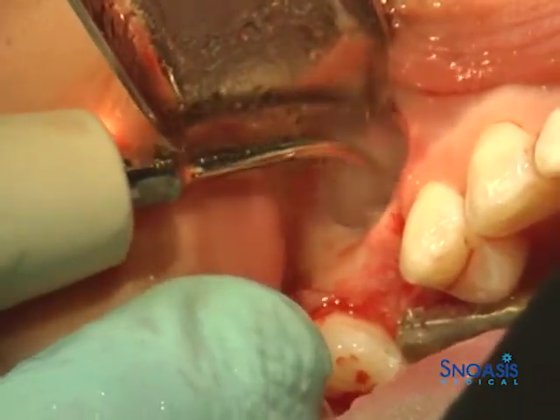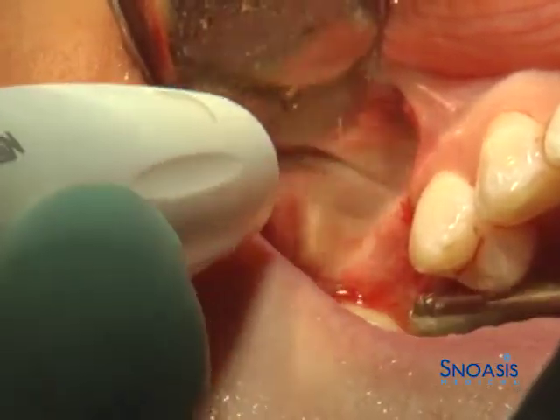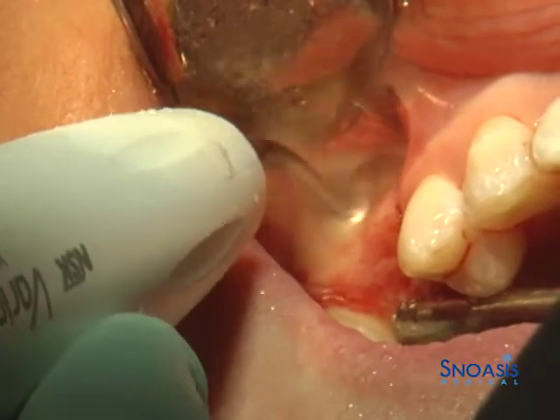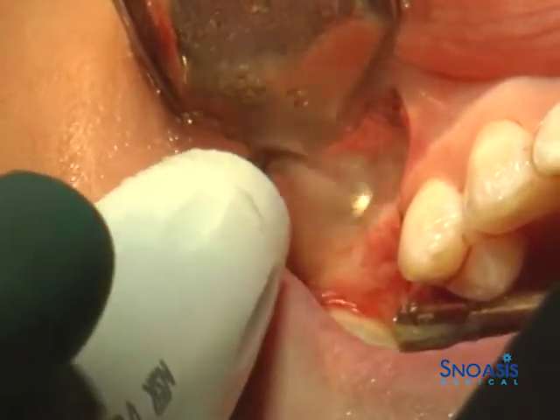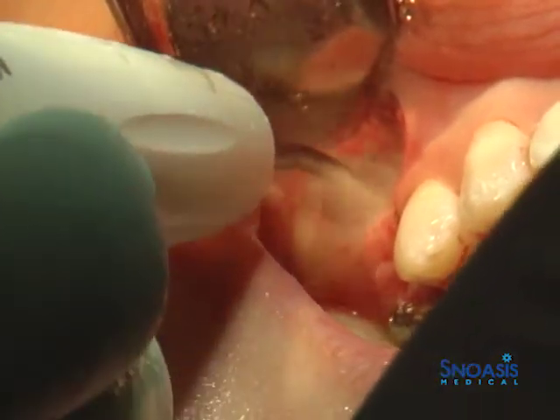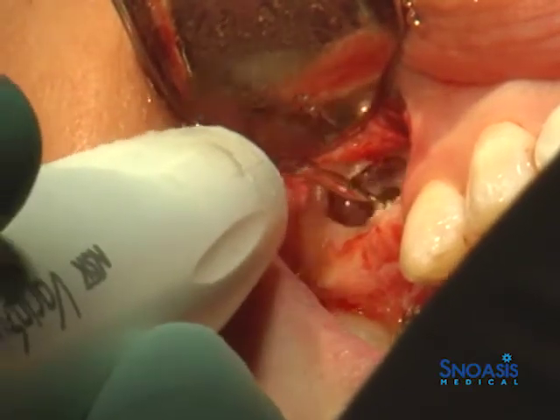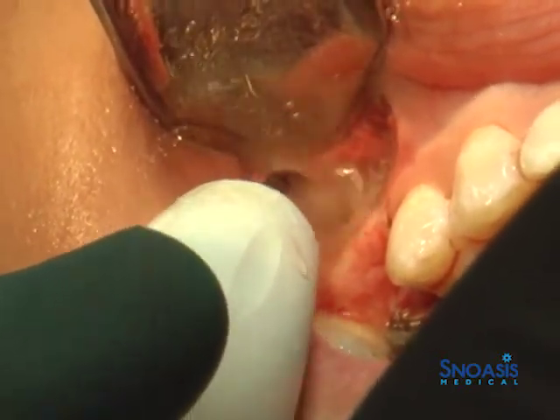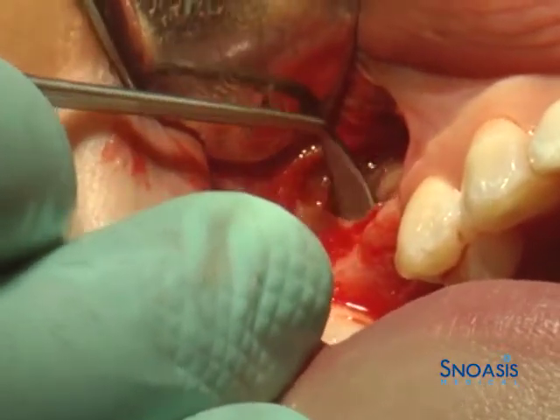A bugle-shaped tip is used for initial Schneiderian membrane elevation, to be followed by hand curettes. Hand sinus elevators are then used for final Schneiderian membrane dissection to allow for adequate placement of particulate bone, allograft, and xenograft.